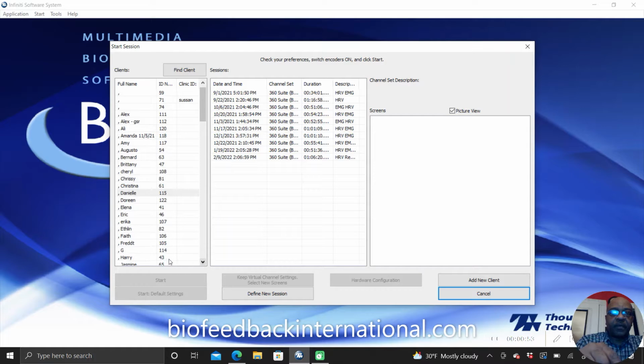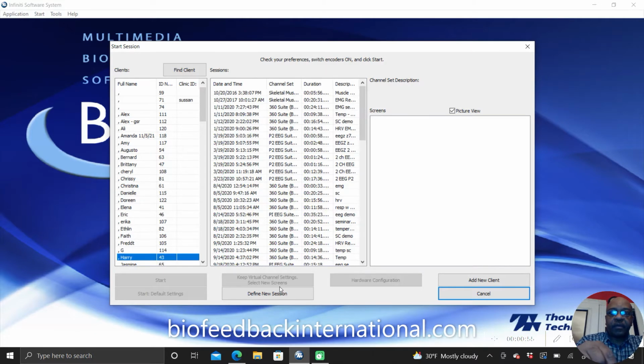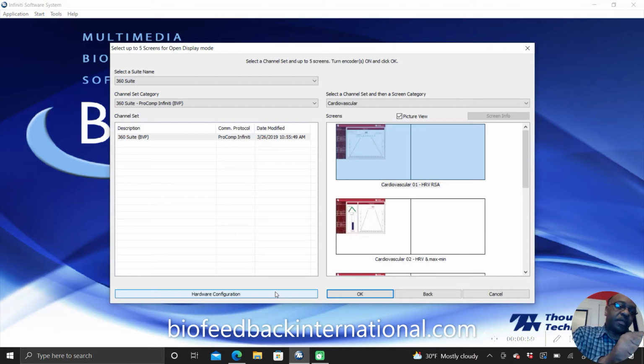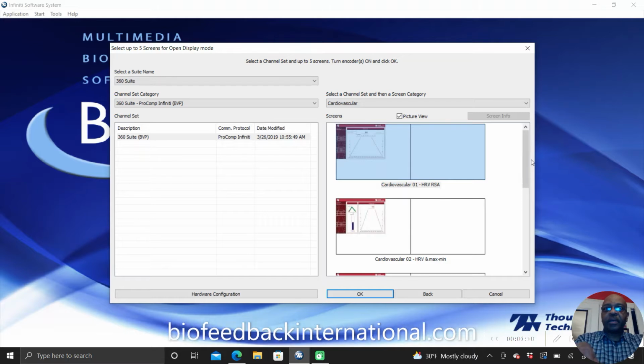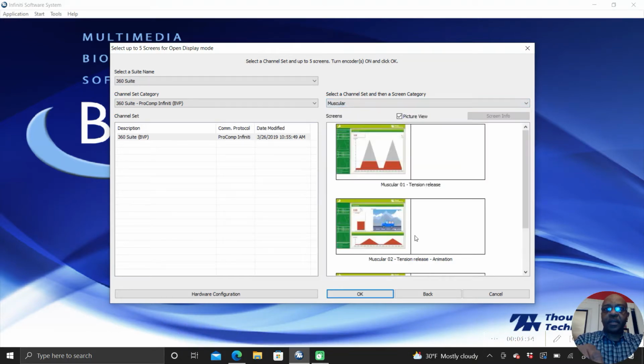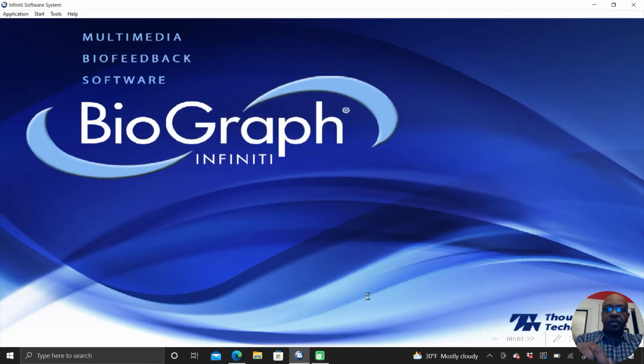I'm in the Biograph Infinity software. This is Thought Technology software, and of course the MyoScan Z is a Thought Technology ProComp EMG amplifier. So I'm going to go into a Surface EMG screen. Let's see. Choose the screen.